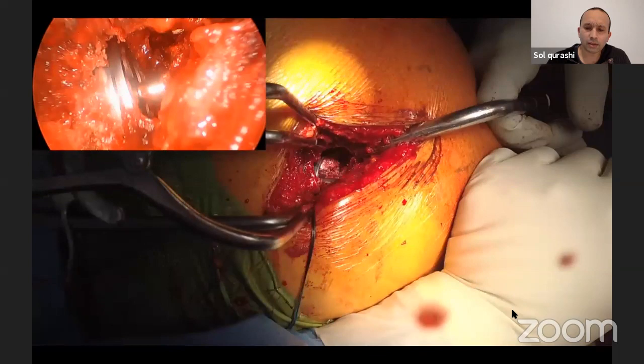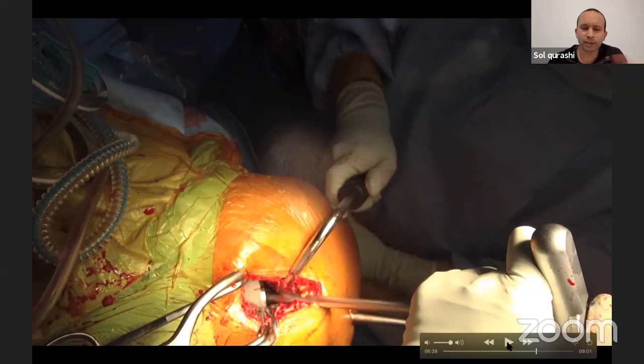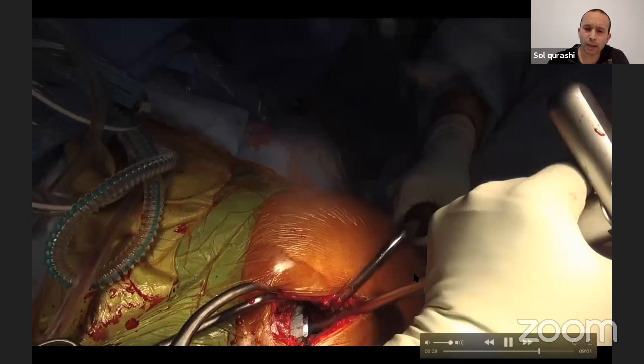Now it's very handy because the definitive cup has this very narrow, slim cup holder. So you can actually vary the version pretty quickly. You're not fighting the femur. I put a little mark on it so that I can line up the screws superiorly, and I don't put the holes in the wrong position. Tap, tap, tap. I'm controlling the cup. Often the fellows are tapping very gently.